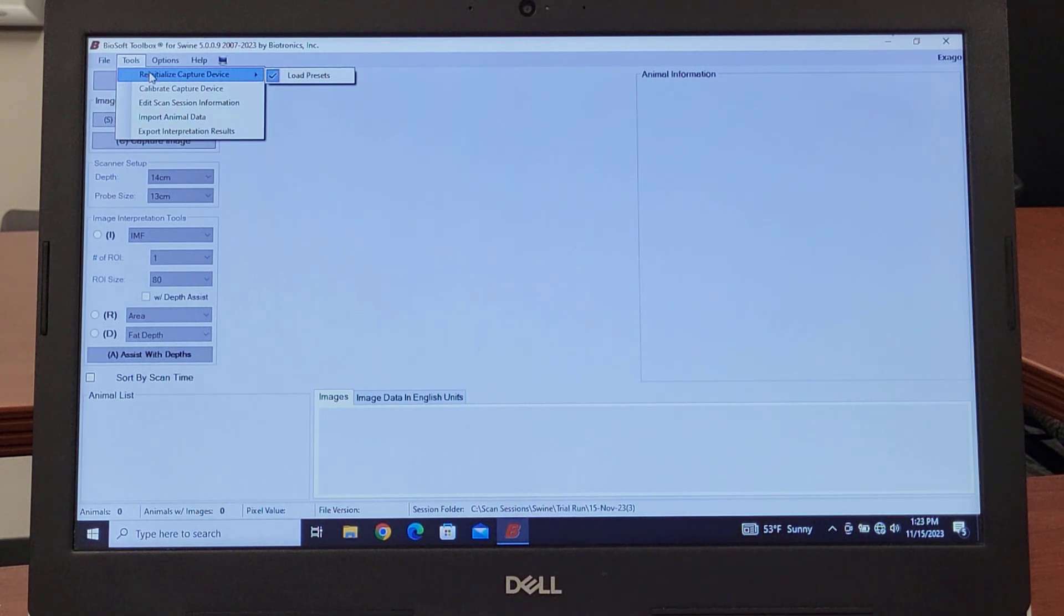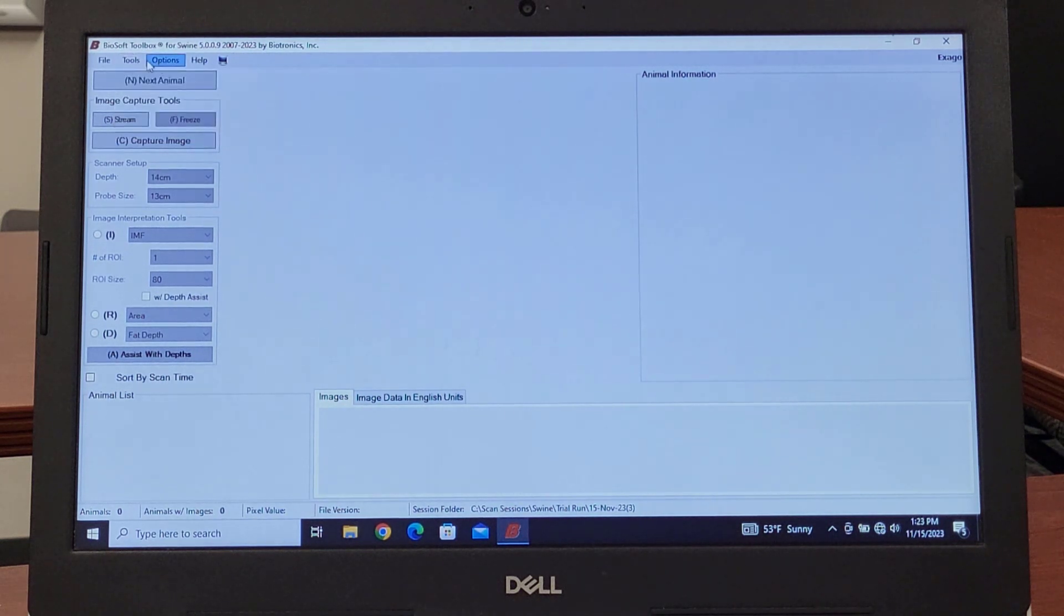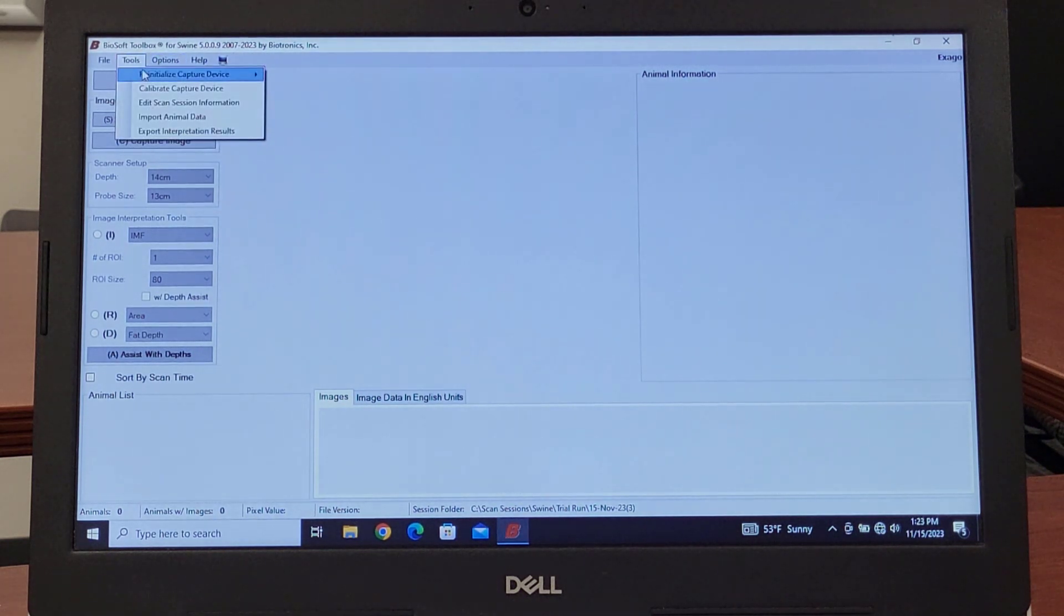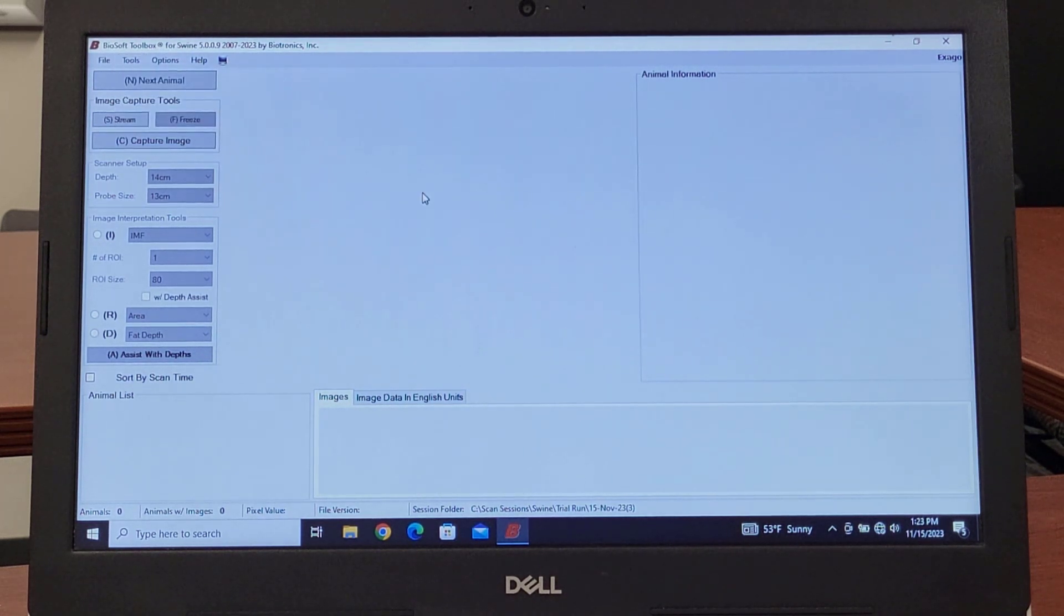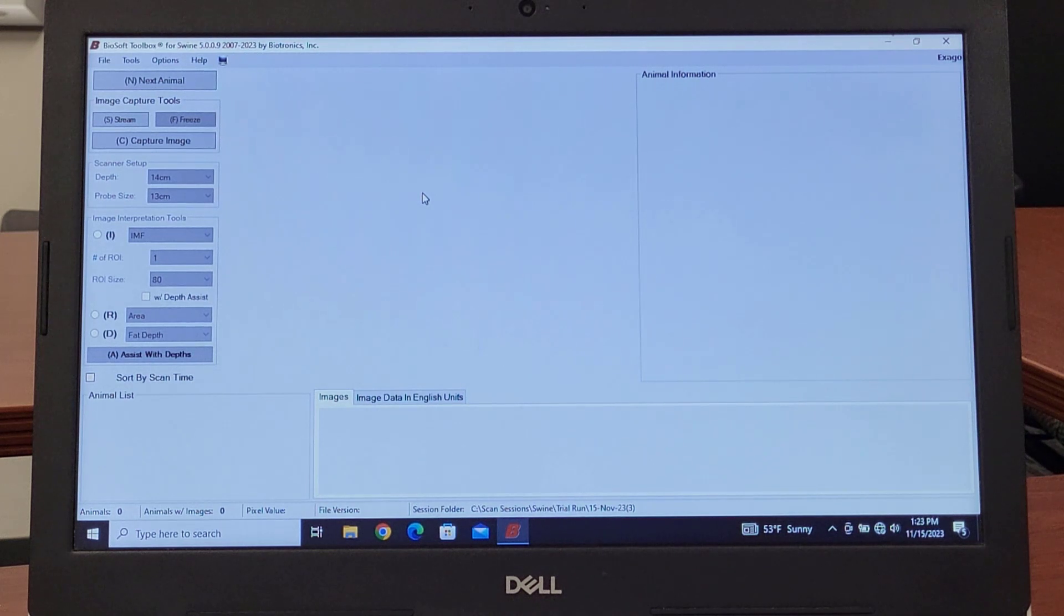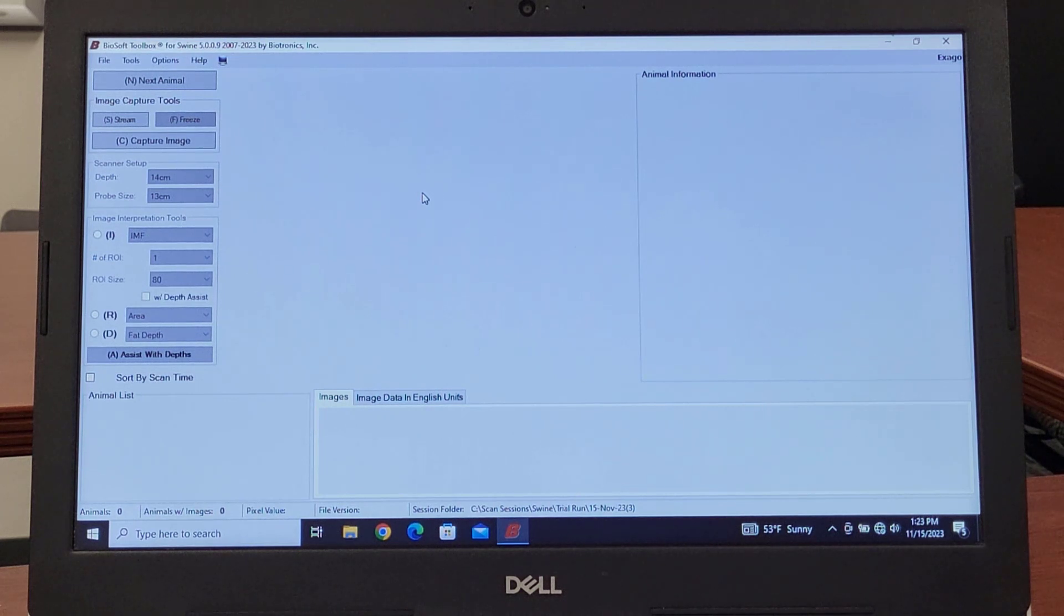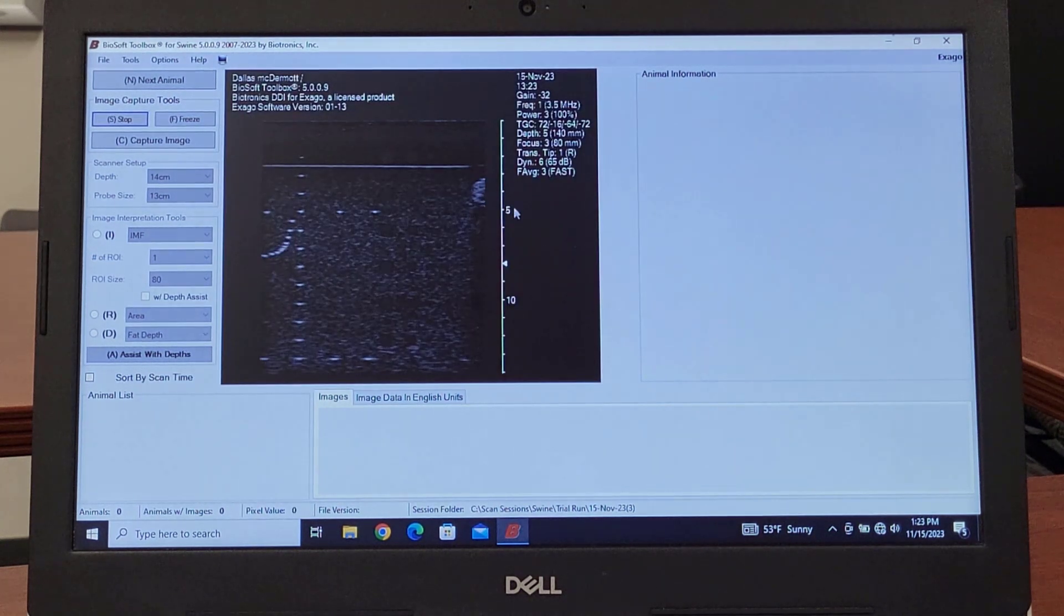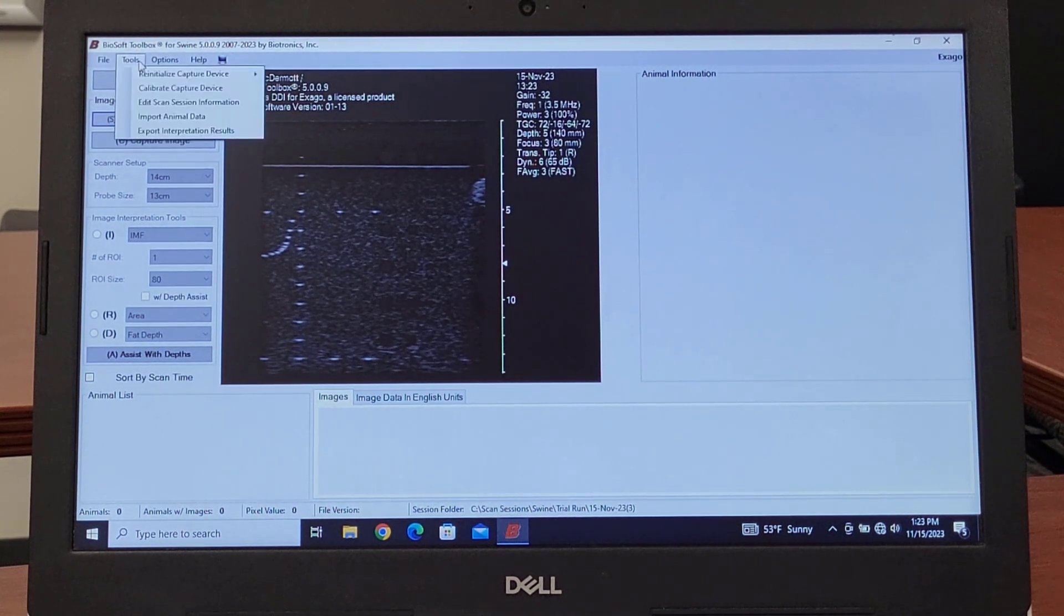You can try this first. Come under Tools and Reinitialize Capture Device and Load Presets. Even though it's hooked up right now, it will go through and reset all of the settings to the defaults, reinitialize the stream that we're getting here.